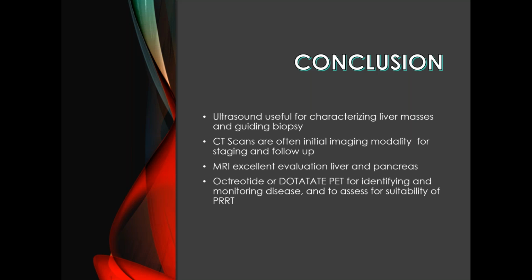Keep in mind that in DOTA-TATE PET studies, we found that the pancreas sometimes has normal islands of pancreatic cells that take up DOTA-TATE, but turn out to not be tumor. And so in those, the research so far has said that with those pancreatic DOTA-TATE avid lesions to defer to the MRI. So the MRI is still, I think people are still weighing more on the MRI of the pancreas than they are on the DOTA-TATE read. So I would probably go with the MRI.